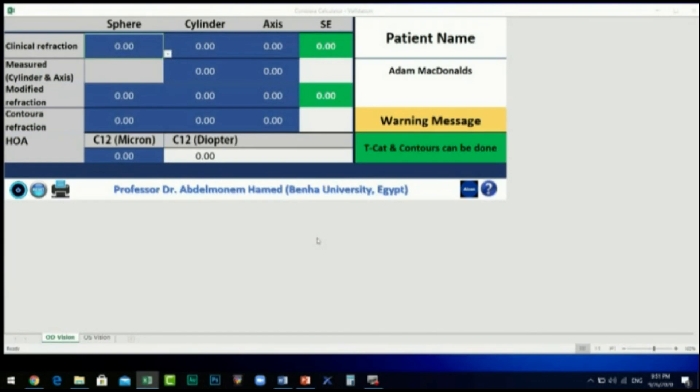The icons at the footer of the Contour Calculator interface, from left to right, are as follows: the Shutdown icon — click it to close the calculator; the Reset icon — when clicked, all data in the calculator will be reset; and the Print icon — when clicked, you can print out the results to keep in the patient file.